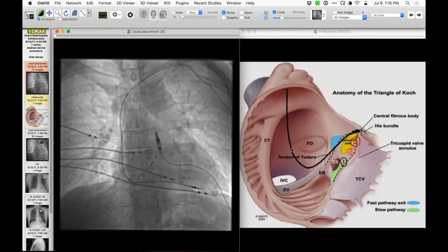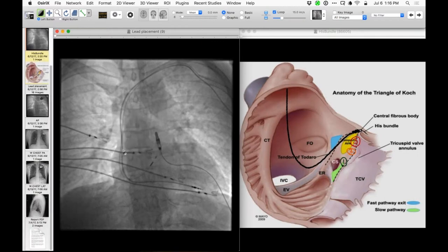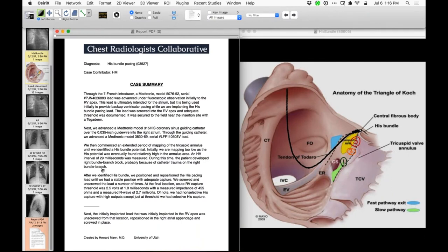Here is an intraprocedural image showing the His bundle lead. They had a temporary lead in the right ventricle that they subsequently moved to the right atrial appendage, but the His bundle pacemaker lead is over there. They go on the atrial side of the tricuspid valve annulus and do some mapping until they find the His bundle potential, then screw the pacemaker lead into that location.